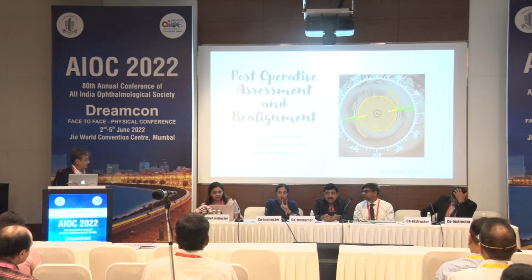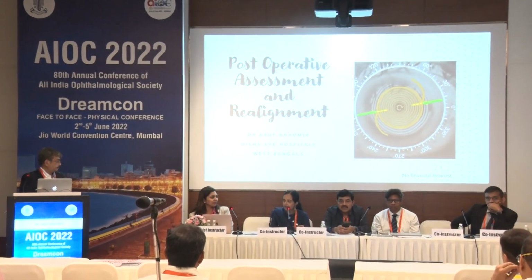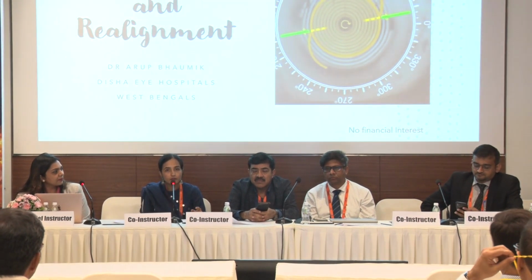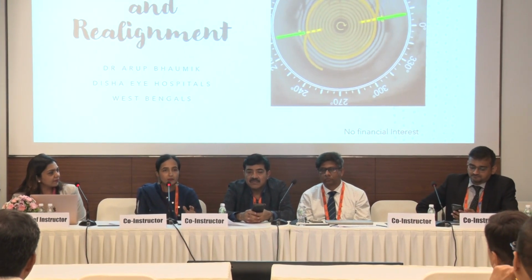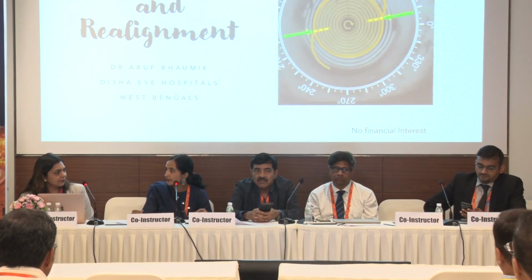So that's a very tricky question, and I don't think it has a clear-cut answer, but if we look at a rhexis run out, if at the end you end up with only that localized run out, it has not extended behind, depending on again the kind of material that you are using. Most hydrophobic lenses across platforms have a very sticky nature, so you could go ahead and do that. But again, I would be very cautious because the other thing is going to be the tilt. So if you are very, very confident in your surgical outcome, then that is one thing I would do for a monofocal or even a multifocal, and I have done because I tend to have all kinds of complications.